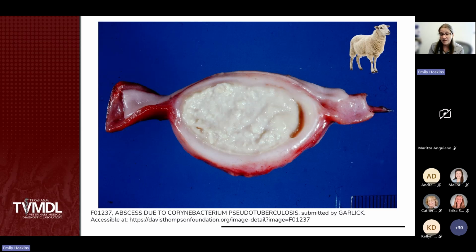And you would be right, except that it is possible that if we were to look at this microscopically, we would see that the predominant inflammatory cell in this lesion is actually a macrophage, and it's granulomatous inflammation, and this is actually a granuloma. And that would be a very different pathologic process and suggest different infectious agents than an abscess.